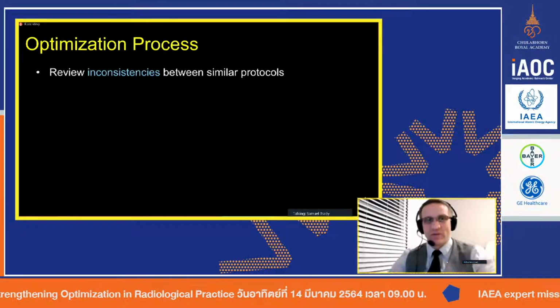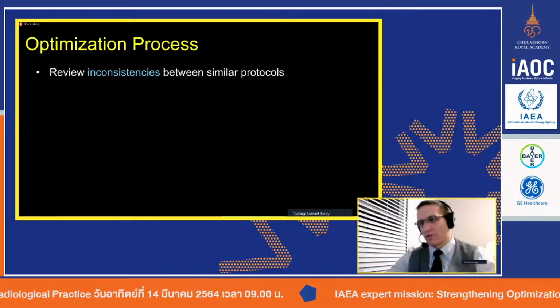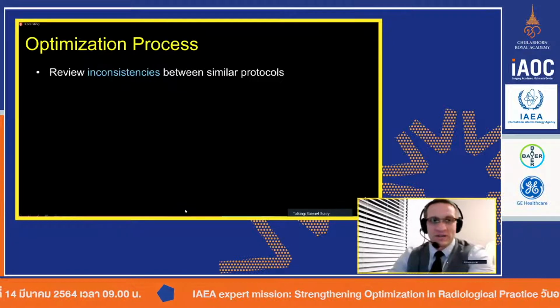We just now are digital. We have to figure out a way to collect those quote unquote not good protocols that we put into our review pile, so that we can then review them on a periodic basis.